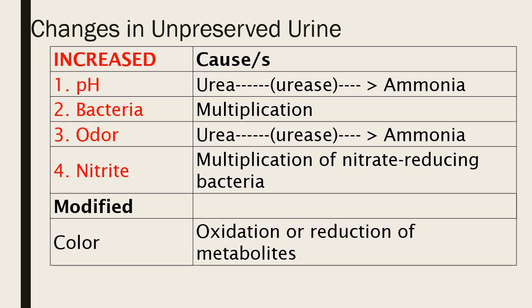And so let's take a look at the changes in your unpreserved urine. These changes will take place right after collection, but metabolic changes are actually sped up 2 hours after the urine is left at room temperature without any interventions. Okay, so let's take a look at the changes in your unpreserved urine.